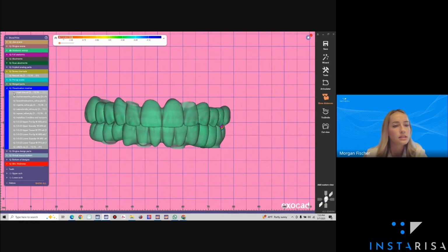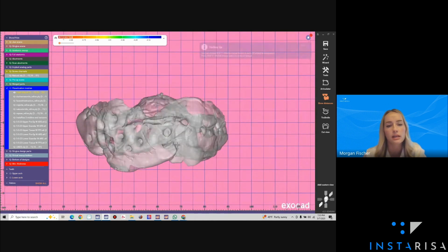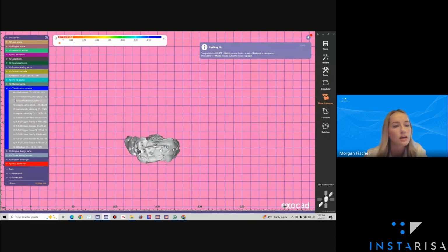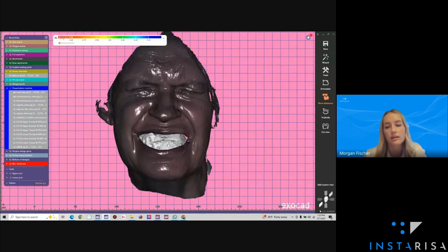So the doctor would have received, we opened with a pre-op mush bite as well. In this case, we aligned everything to the face with retractors. We see nice, good camouflage there. This is the patient in Duchenne. Looks like we have a really big smile line here.